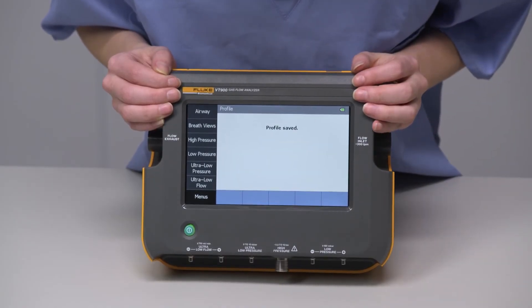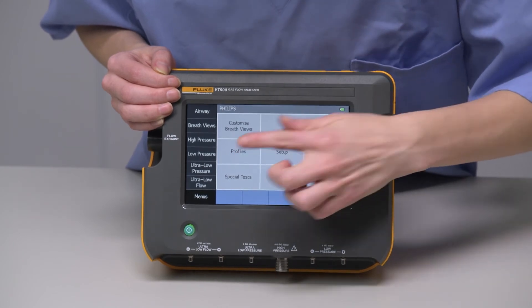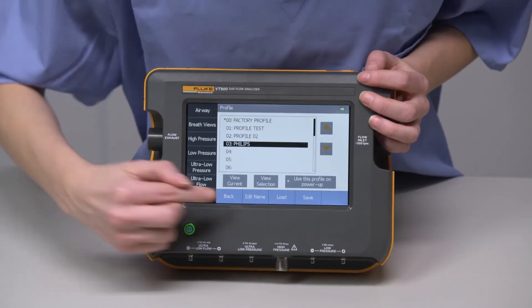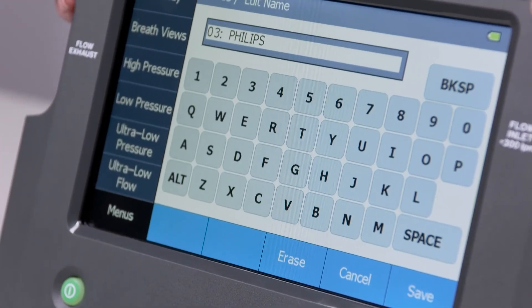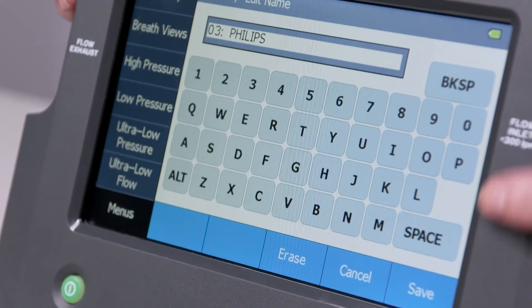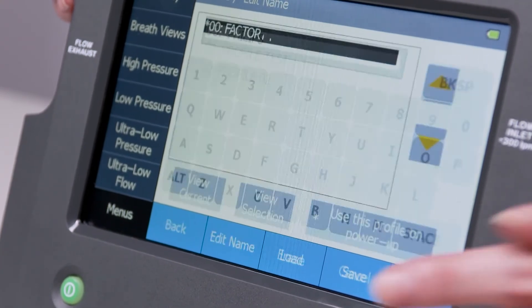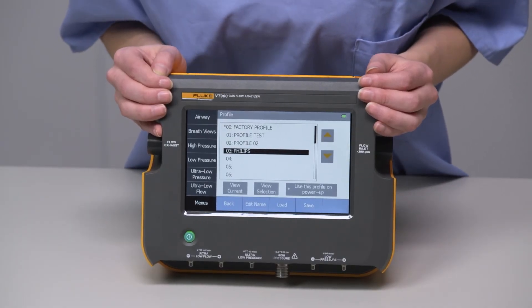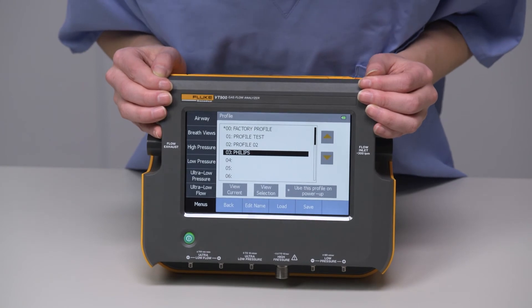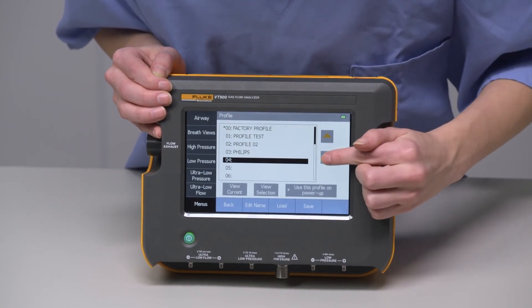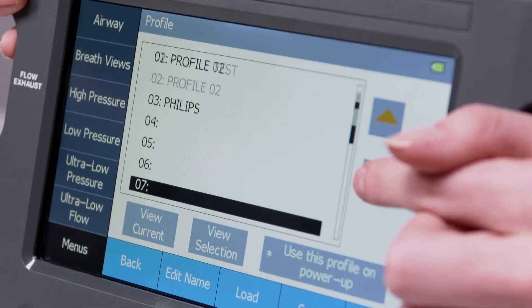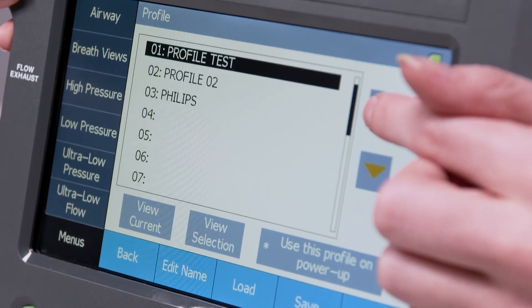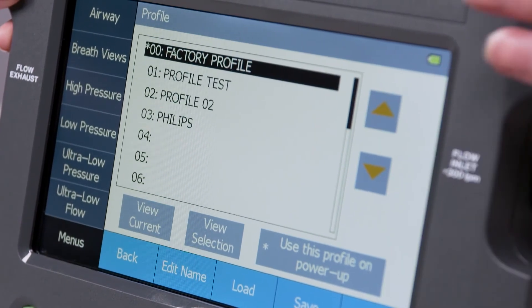It's best to name the profile right away. To do this, click Edit Profile, then press Save. Your profile is now saved and ready to use for a future test. You can now see the list of all saved profiles. You can create and save up to 20 profiles.